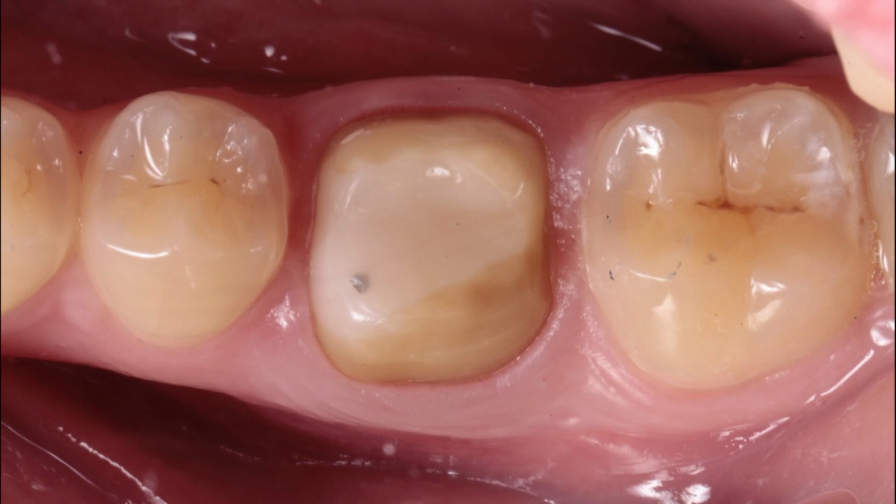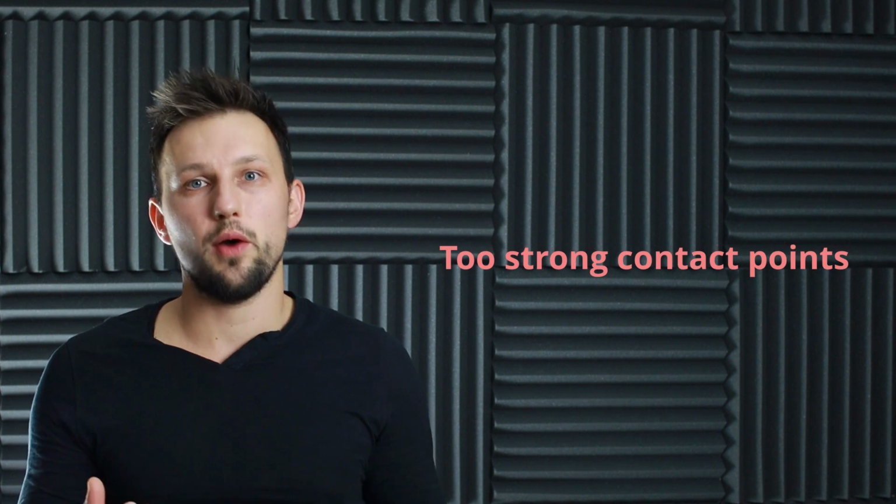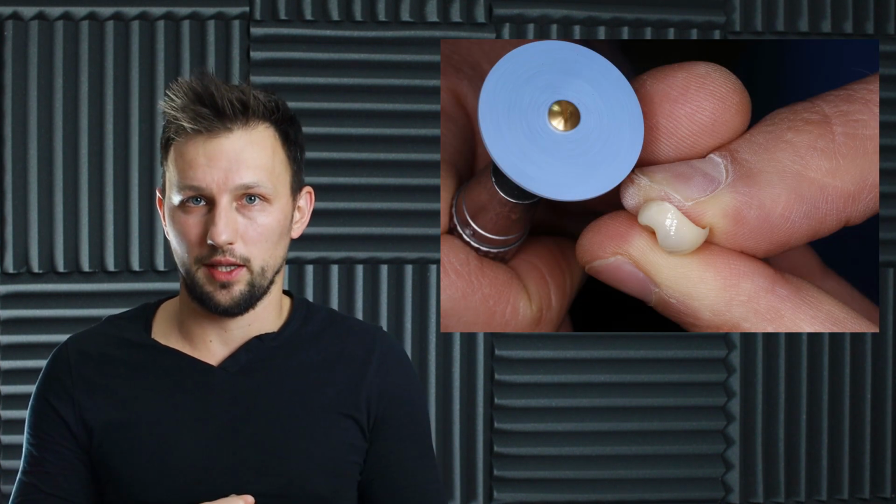And in fact, the gum was perfectly healed. Almost always there is the same situation when we don't have the temporary crown. But when I checked it on the abutment in the patient's mouth, it turned out that the contact points were just too strong and the crown was not in a good position, so it wasn't stable at all. So what I did, I just reduced the contact points.